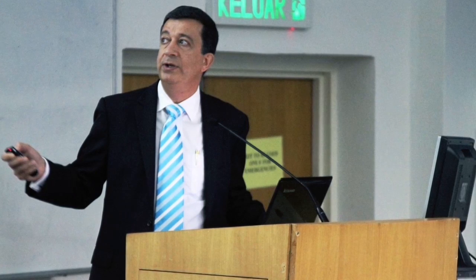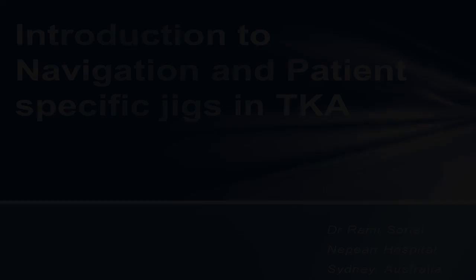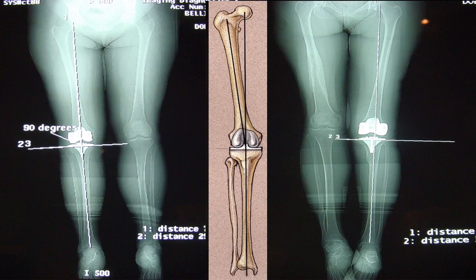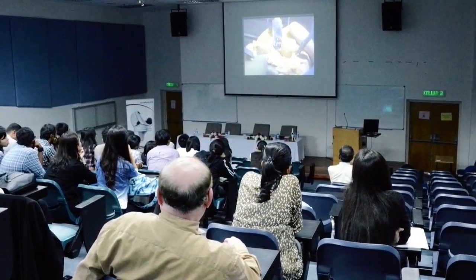Well, this is a one-day workshop that involves presentation of didactic material, incorporating really the basics of total knee replacement, including anatomy, the kinematics, the biomechanics of knee function, as well as the kinematics and biomechanics of arthroplasty, as well as the techniques, the surgical approaches, and the selection of patients, selection of implants, and some of the complications, including live video streaming of these procedures.